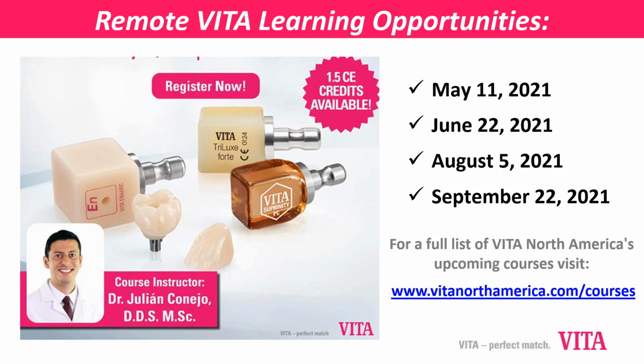As a prosthodontist, I like to do a lot of indirect, so I make this sleeve. And we have to remember that if we have an endo-treated tooth and it's discolored, it's not only the clinical crown or the part of the prep that we see, that root is also discolored. So zirconia can be milled with a very thin margin, and we can place that slightly subgingival, and zirconia in a very bright shade basically illuminates that soft tissue and actually reverses the umbrella effect of having that grayish around.